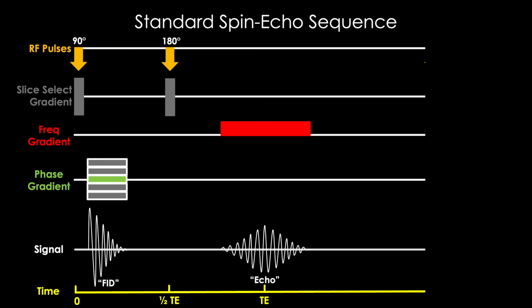And again, we wait until this time point TR, at which our net magnetizations have rebuilt, before starting the process for a fourth cycle. And finally, a fifth cycle. So in this example, we've performed the cycle 5 times with 5 unique phase encoding gradients.